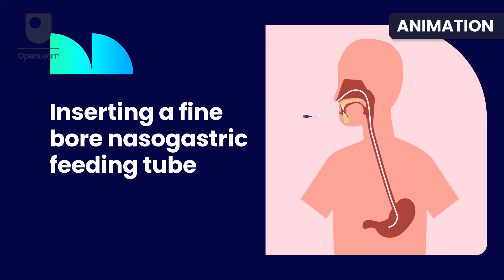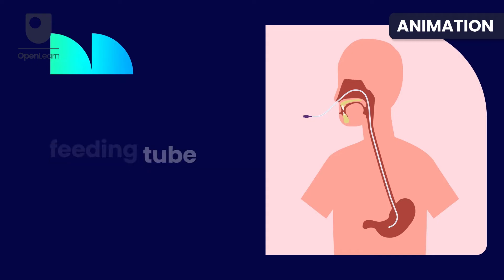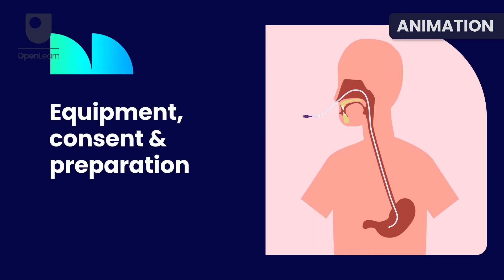In this video, we will discuss the safe insertion of a fine-bore nasogastric tube for feeding purposes in an adult.